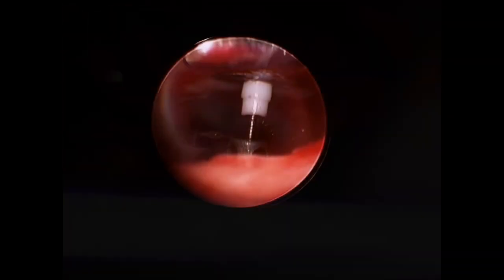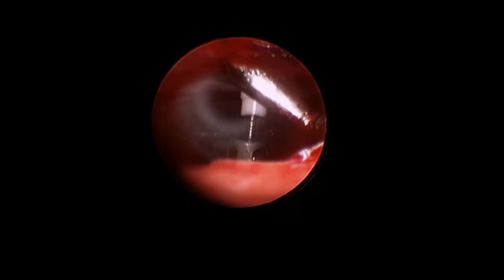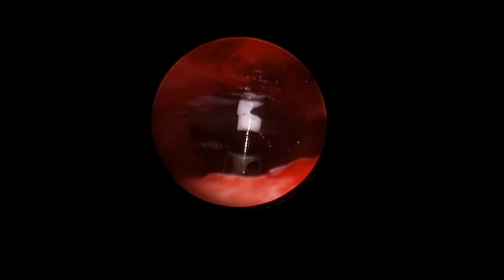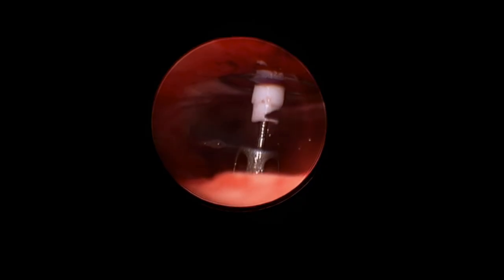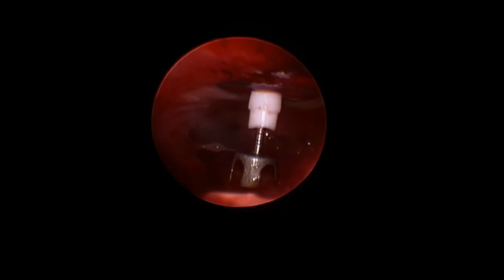So you can see there I'm feeling the edge of the bone, and there I'm feeling that the PORP is contacting the undersurface of the cartilage. And I'm just going to move it a little bit ahead to improve its visibility with the endoscope. And now we're happy with that position, and we'll pack the middle ear with some gel foam, with some steroids in this case, because we want to minimize new scar formation.